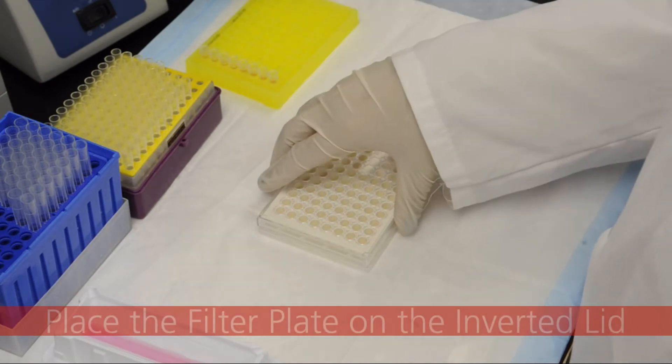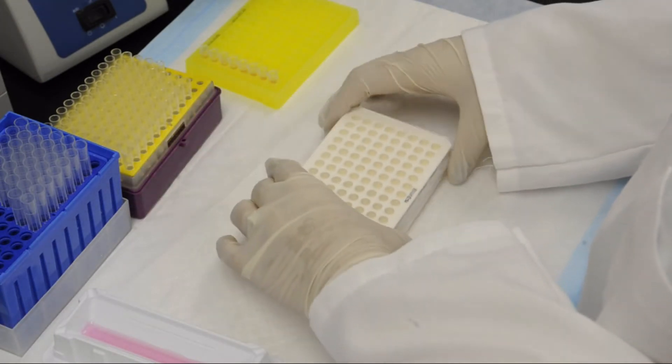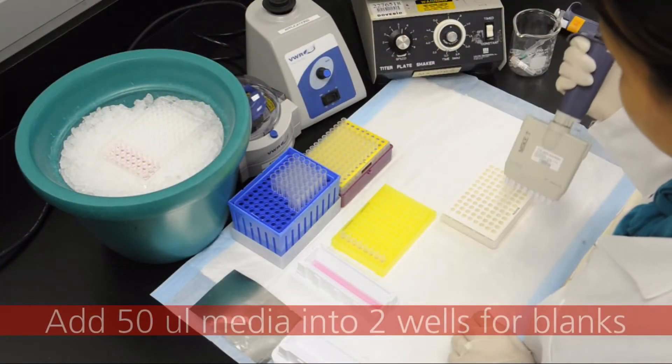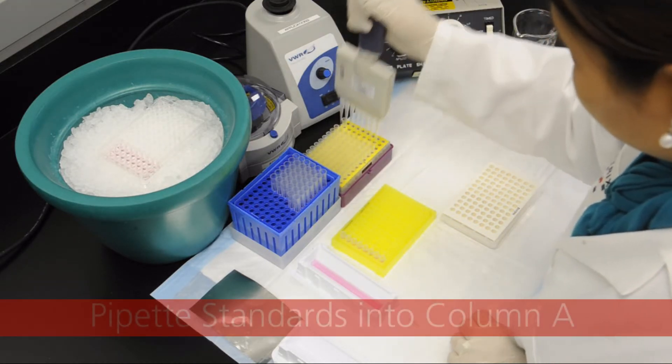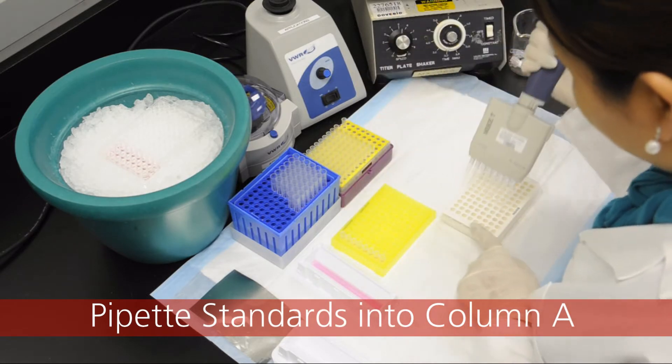Remove the lid of the filter plate, invert, then place the filter plate on top of the inverted lid. Pipet 50 microliters of media into 2 wells of the filter plate to act as blanks. Transfer 50 microliters of the standard using a multi-channel pipet into column A.